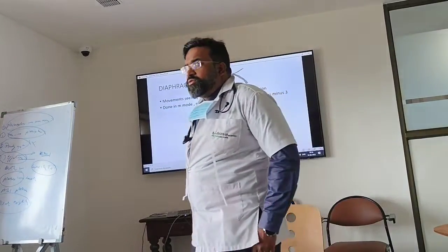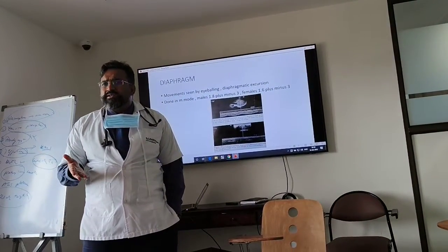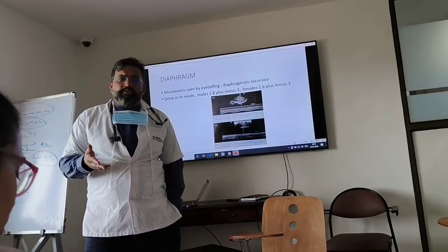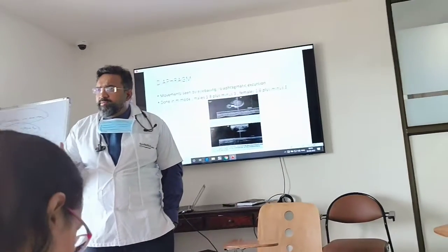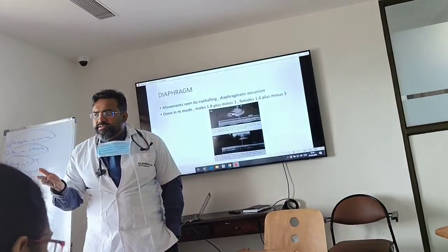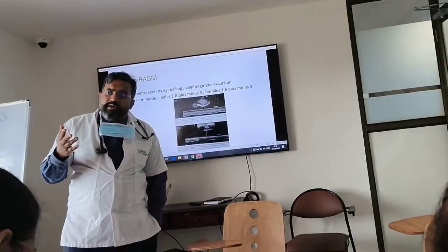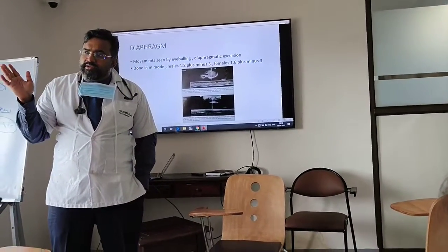So you never do it when the patient is on the ventilator, because the ventilator is pushing air. So what are you going to get with that? A diaphragmatic ultrasound is done when the patient is off the ventilator or on a T-piece. Are you understanding? So if you want to do diaphragmatic ultrasound, what do I require to do? I need to take the patient off the ventilator.